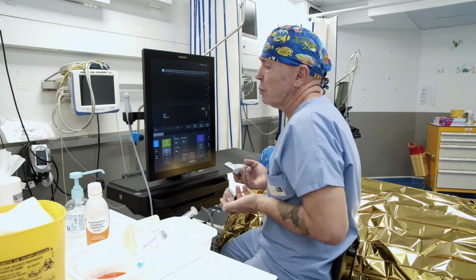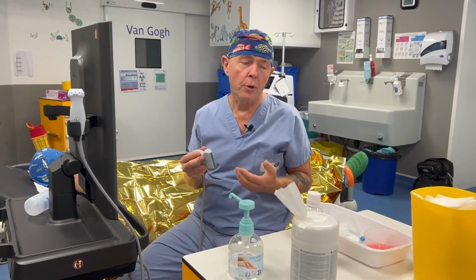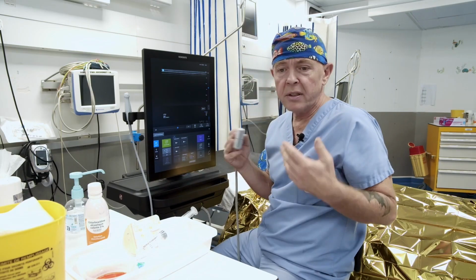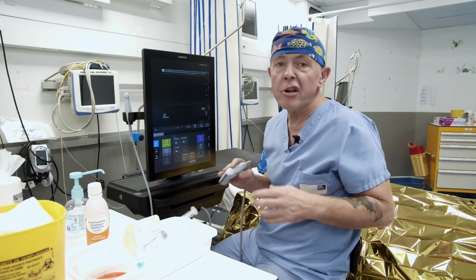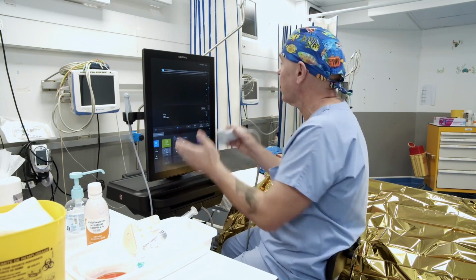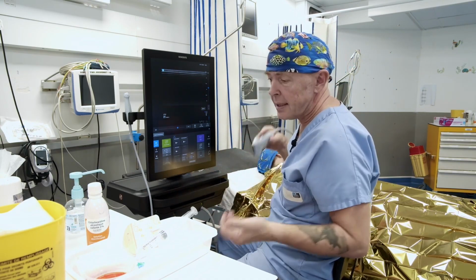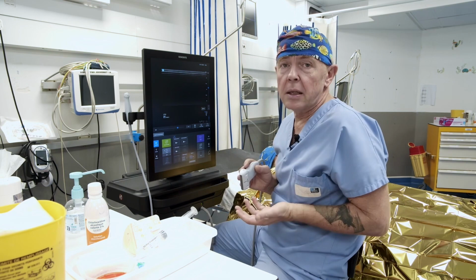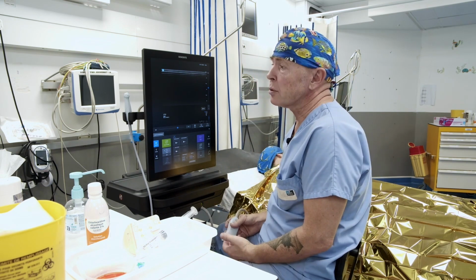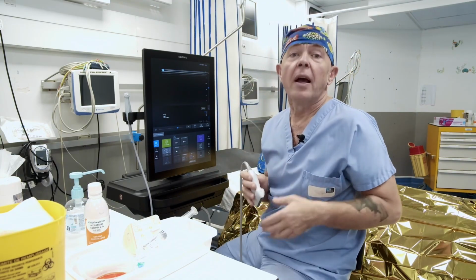Well, there is additionally a rather straightforward method to observe, which is to genuinely visit the various internship locations to witness how the different teams have fully embraced their established routines. Choose for yourself, adapt to your environment, at home, in operating rooms. There's no absolute rule. You can place the screen here or on the other side. You can sit down, that's almost a personal constant. Above all, try using both hands. Following this, carefully observe the detailed demonstrations conducted by experienced professionals, those who are actively involved in the practice. Importantly, this will constitute the final step of the 5 comprehensive steps of the Evolubloc methodology.